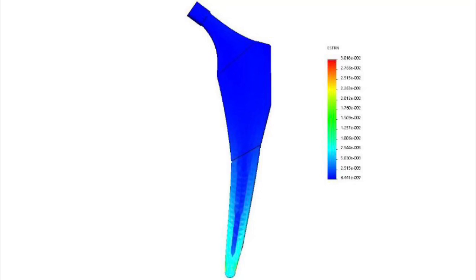So in my stem, I noticed that it's strong throughout. However, on the lower part of the stem, I get a greenish color, which could indicate a slight pressure. Because I used the 2000 newtons, I could get that slightly green, or the way that the model was done through meshing, it could be that I happen to get the greenish color, but it's nothing major. It's more to be considered slightly if I was to carry out more tests throughout the stem.